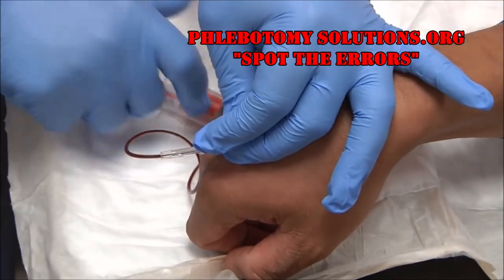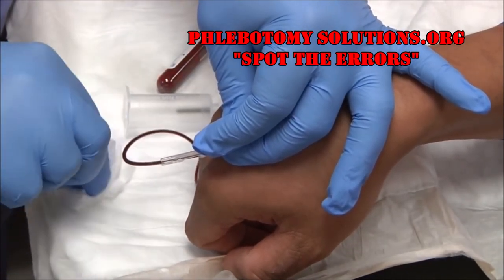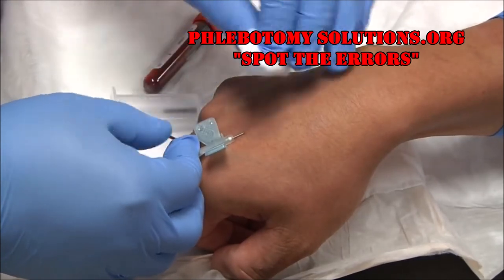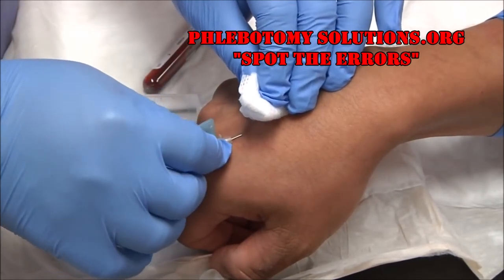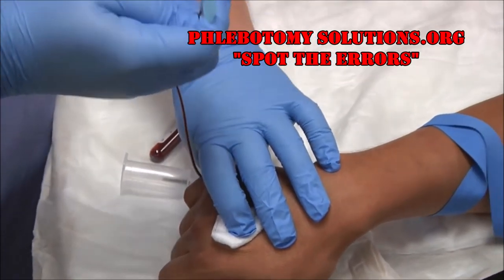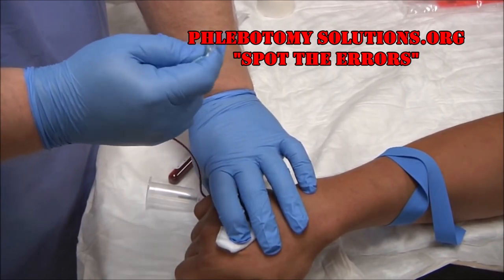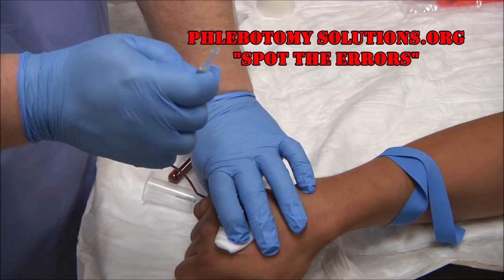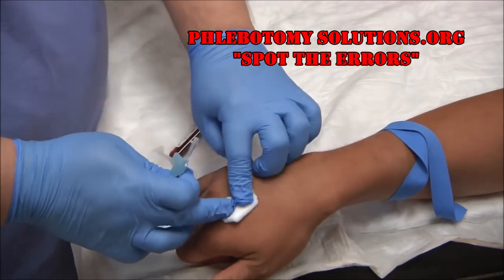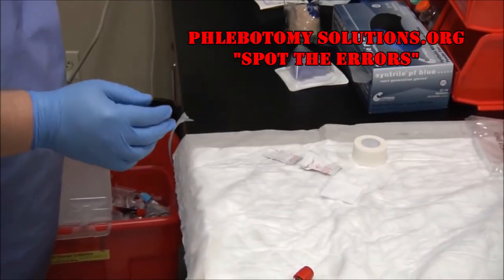Once the tube is full, release the tourniquet and disengage the tube. Grab your gauze, fold it over once, fold over twice. Pull the needle out using the tabs and cover, holding pressure for just a couple of seconds. While doing that, go ahead and activate your safety feature — pull the plastic sheath over the needle, pull the wings back, and it locks in place. Ask your patient to hold the dressing for a second and immediately take the needle to the biohazard box. We never set used needles down.